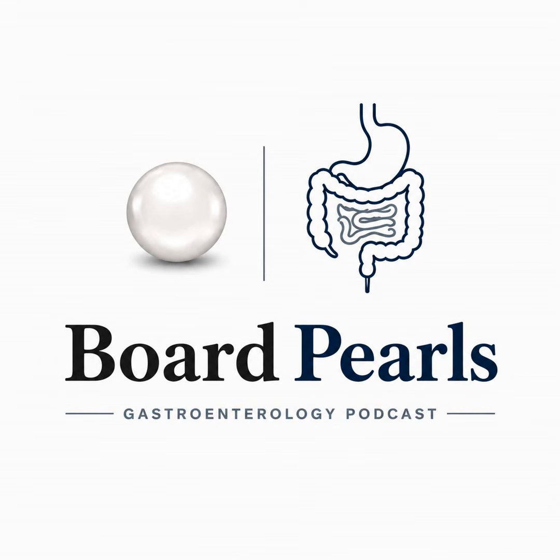Pacemakers as a capsule contraindication sound right and are wrong. Grading a complication by what it felt like sounds right and is wrong. Each of these has a clean principle that replaces the reflex, and that principle is the teaching. Start with antibiotic prophylaxis, because the misconception this domain is built around is the prosthetic device.